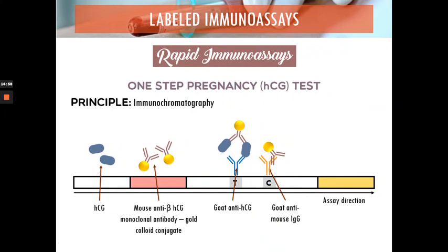Okay? So it would depend. Again, the reagents depend on the manufacturers and also on the sample or analyte that you want to detect. Okay? So I hope you get it, dears. So this is just an additional lecture on labeled immunoassays, specifically on test kits, immunochromatography, so that you will understand what happens inside the test kit.